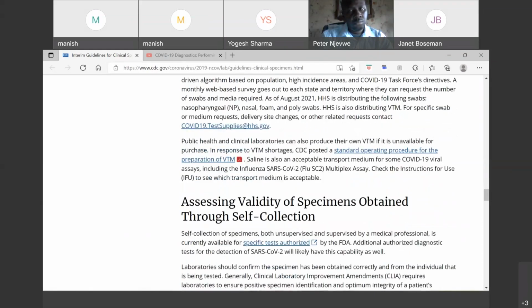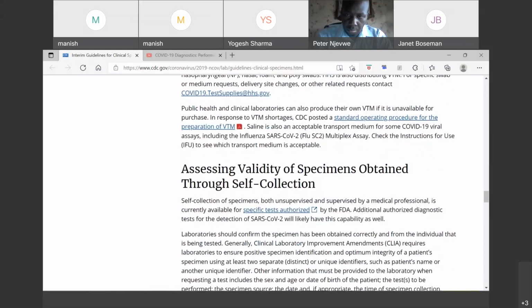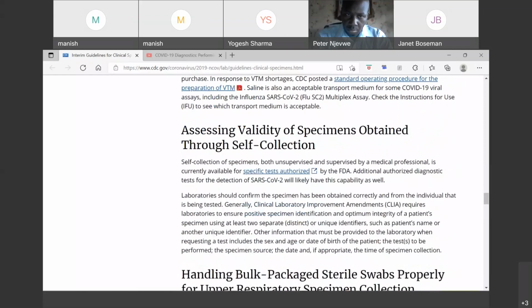In response to the VTM shortage, CDC posted a standard operating procedure for the preparation of VTM. Saline is also an acceptable transport medium for some coronavirus viral assays. Saline is nothing but 0.9% NaCl, sodium chloride. It should be sterile. That can also be used for the collection of specimens, including for influenza, SARS-CoV-2, flu, SC2 multiplex assay. Check the instructions for use, IFU, to see which transport medium is acceptable. We'll have to check which kind of transport media is suitable for which virus.